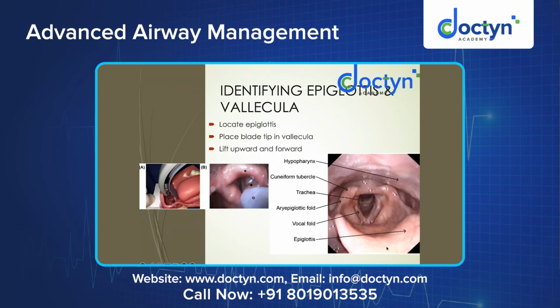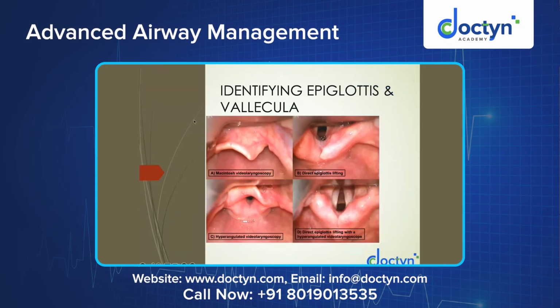You see, this is the reverse image of it. So the epiglottis is here, vocal cords, and the trachea, where we could see the first tracheal ring visible here. So some more images for better understanding. This is the tip of the laryngoscope, which is placed just above the vocal cords in the vallecula. Once inserted, you could see in image C the epiglottis lifted over the laryngoscope blade, and you will be able to visualize the vocal cords here.